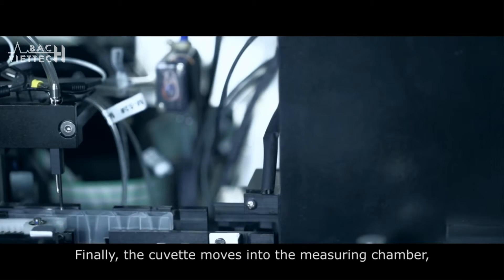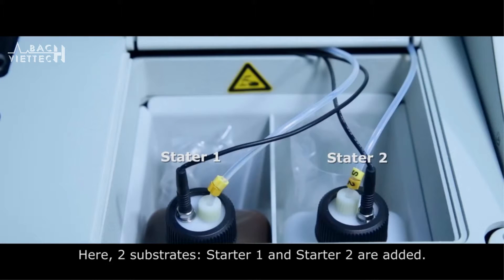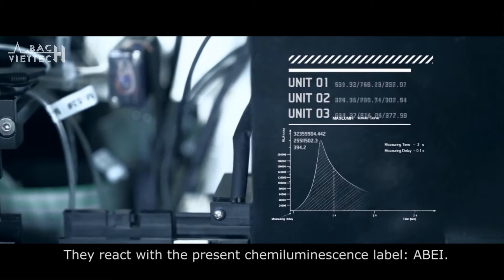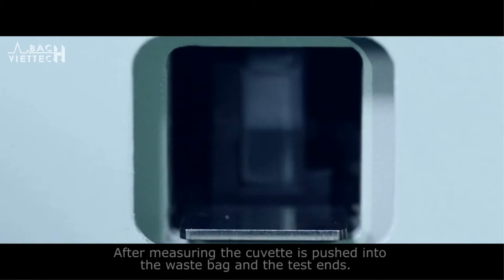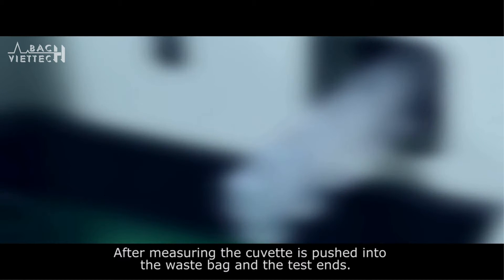Finally, the cuvette moves into the measuring chamber, which is a darkroom environment. Here, two substrates — Starter 1 and Starter 2 — are added. They react with the chemiluminescence label ABEI. After measuring, the cuvette is pushed into the waste bag and the test ends.